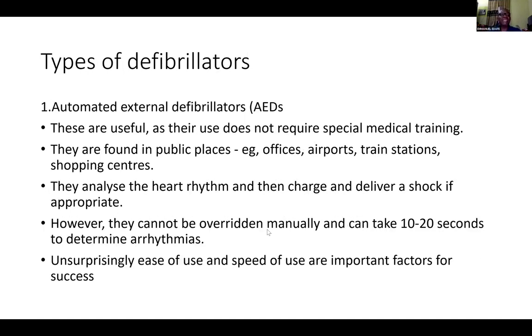We have various types of defibrillators in the market. Number one is the AED, the automated external defibrillator. The first sets that were in the market were the monophasic. But nowadays, most of the ones that are available are the biphasic. Now, what happened about this is that they are not actually developed for the doctor only. They are developed for the layman. They are developed for the marketplace, for the offices, for the industry, so that you can do something before the paramedic gets there. That is why you notice that they are everywhere in town. They can be found in marketplaces, in supermarkets, shops and the rest of them.